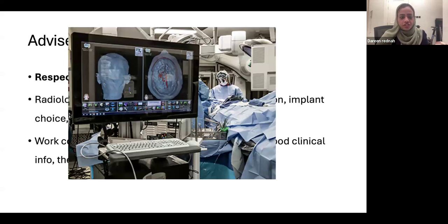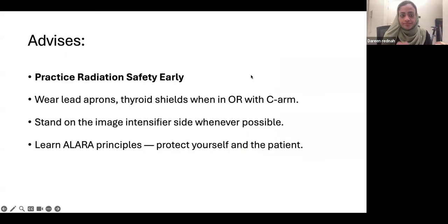This is the role of radiology intraoperatively. I put this slide just to tell you something also. When I plan a tumor, I print the images with the neurovascular bundle and the dimensions, and I put them in the surgery. Sometimes we have a computer where we put the images, and during the surgery we keep reviewing them. What is the nerve distance, even if we know it? What is the length of the tumor? What are the details? We keep the monitor and do the surgery, watching the images.